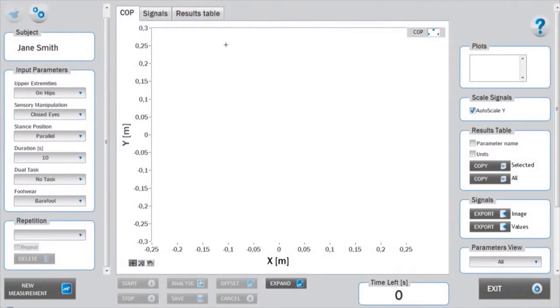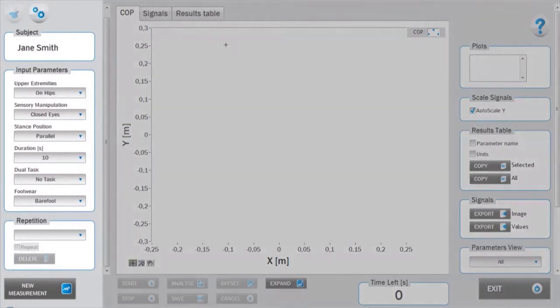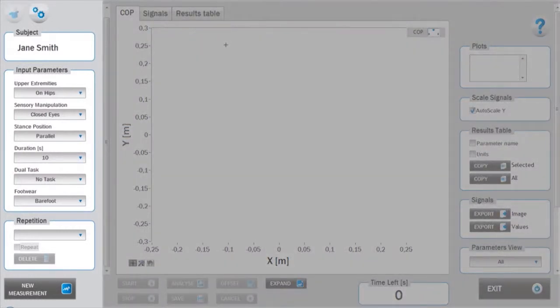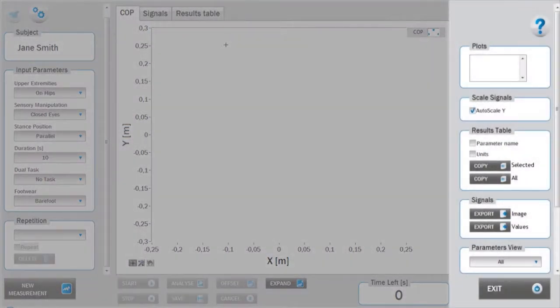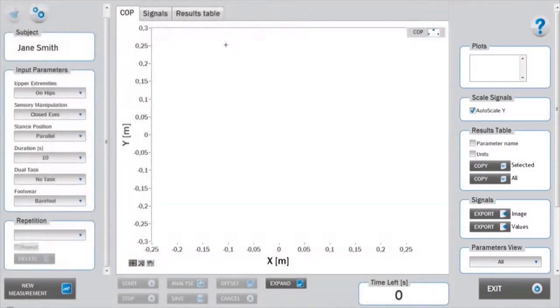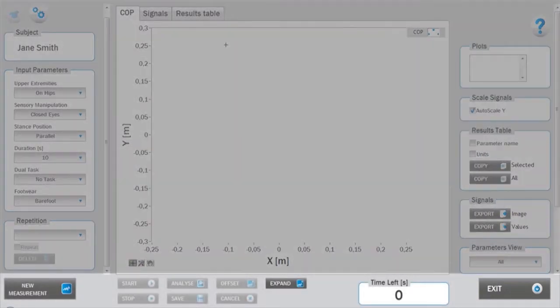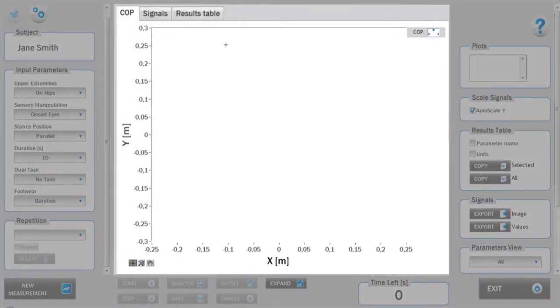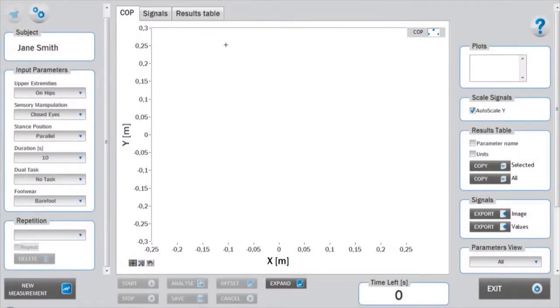As with the organization of all the MARS test modules, the interface is divided into left setup panel, right analysis panel, bottom measurement panel, and the central signals and results area. Before starting the measurement, appropriate input parameters must be determined in the setup panel.